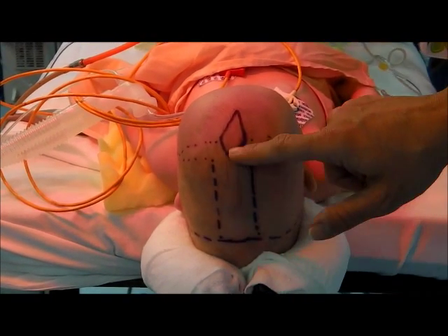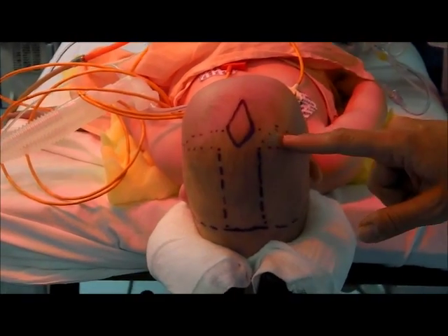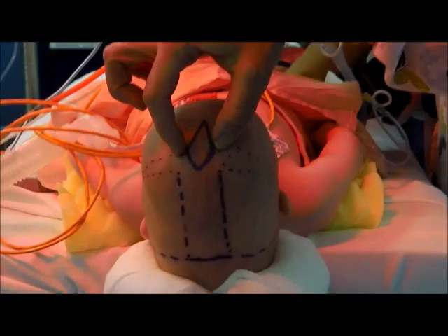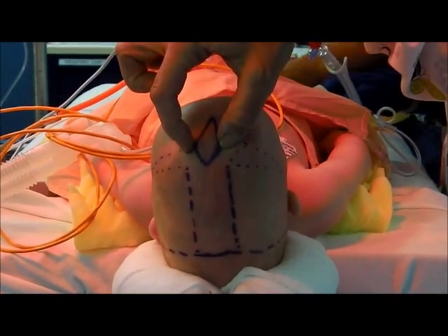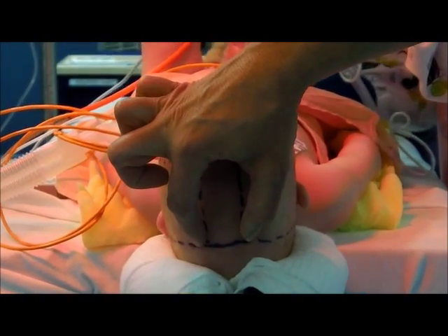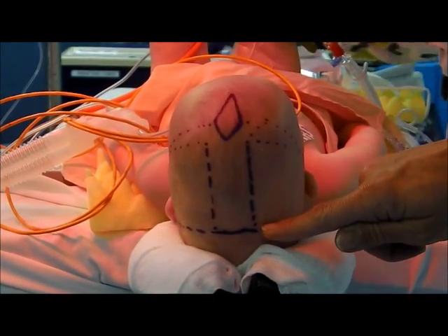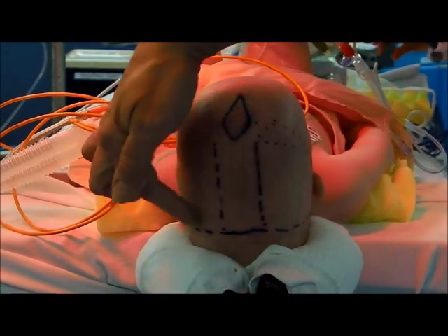After we've removed this piece of bone, I like to make an incision and remove the bone here and here, all through that same tiny incision on his head. We'll make a second incision back here to help remove this piece of bone, and also make a cut in the bone this way and this way.